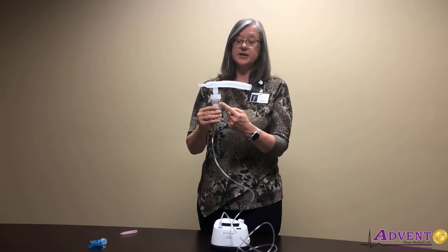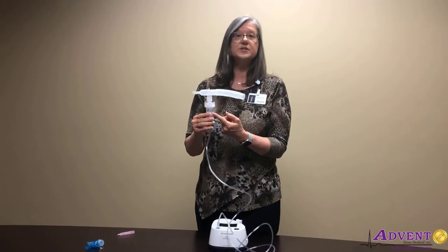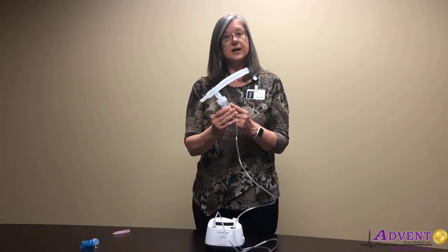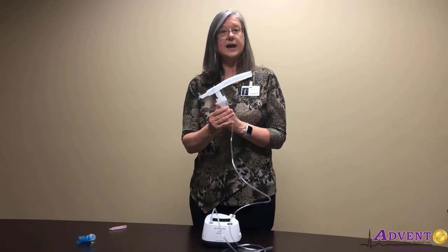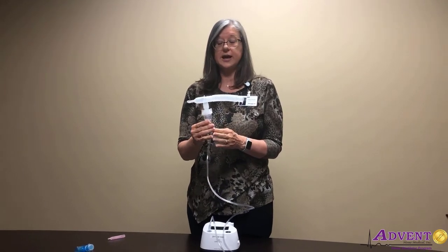An important thing is to make sure that the nebulizer cup is straight up and down during the whole process, because it pulls the medication from the bottom of the cup. If we tilt that cup, the medication goes to the side and it has a more difficult time picking that up and making it available for you to inhale.